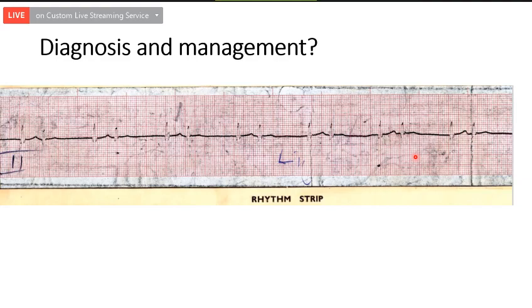That is known as echo, because an ectopic beat which started from the ventricle went back to the atrium and came back to the ventricle. That's echo capture bigeminy. So there are about seven conditions which can give rise to bigeminal rhythm. So you should remember it. Sometimes bigeminal rhythm can occur as a short note. So you should remember there are seven conditions.